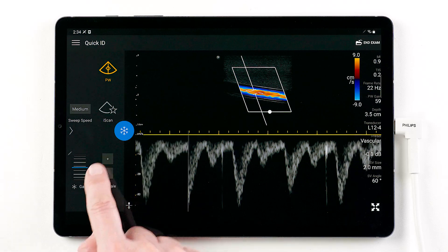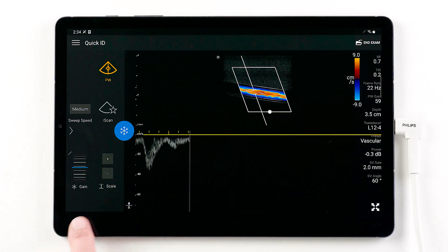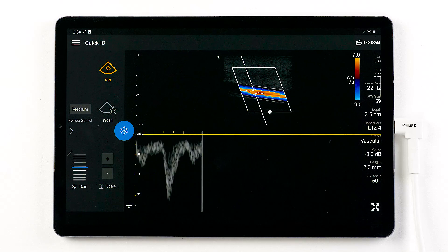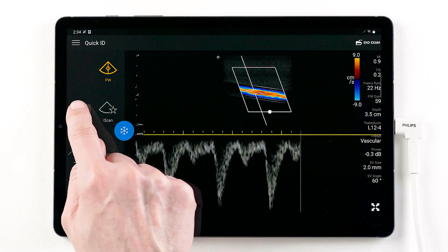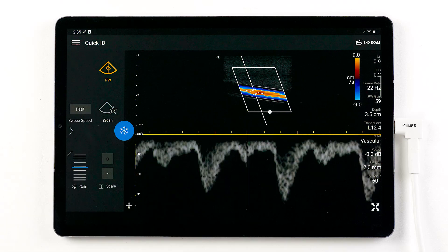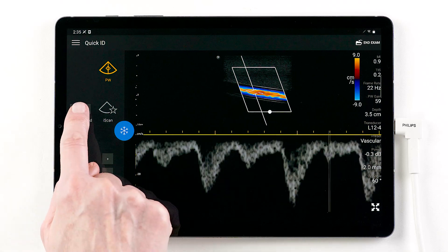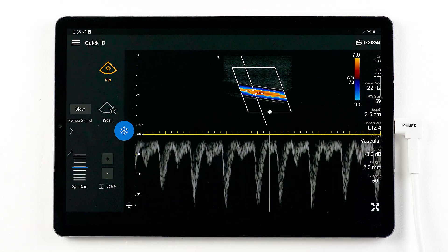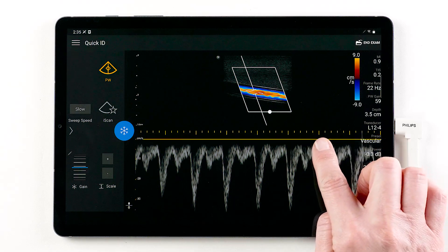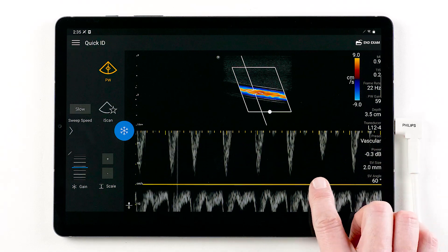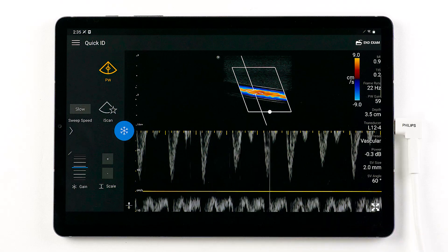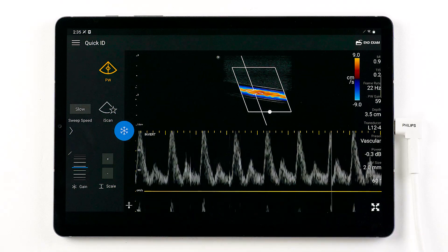Increase and decrease the scale, change the sweep speed, and drag the baseline.